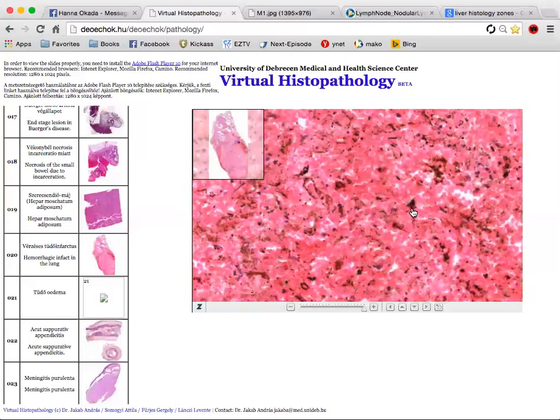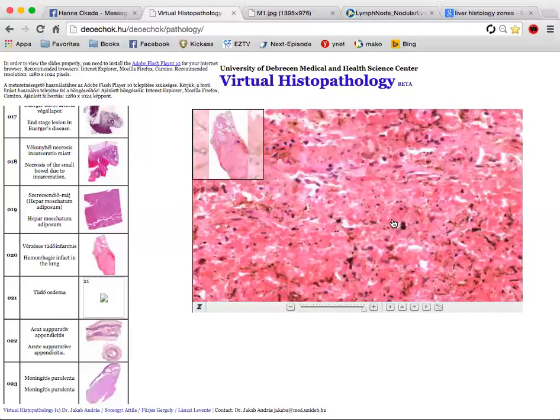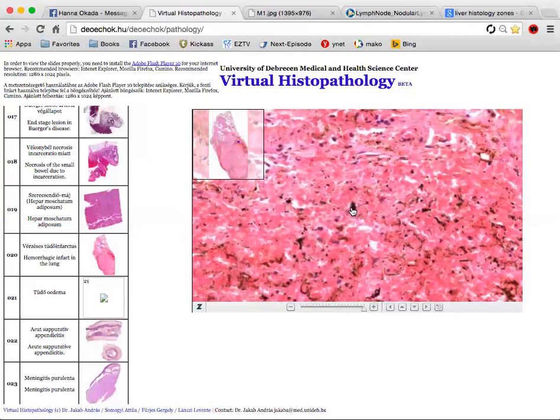If you remember from autopsy, the lungs are kind of dark. There's a lot of black on them. Especially in Debrecen, there's a lot of dust. So people who lived in Debrecen all their lives will have these really blackened lungs, even if they don't smoke, which most of them do. This is a physiological condition, right? Yeah. If you live where there's no dust, then your lungs might not have all this coal in them. But the lungs are prepared for dust. They have these macrophages, these dust cells, that phagocytose it, so it doesn't hurt the normal tissue.